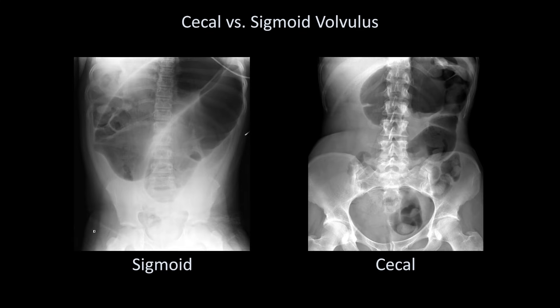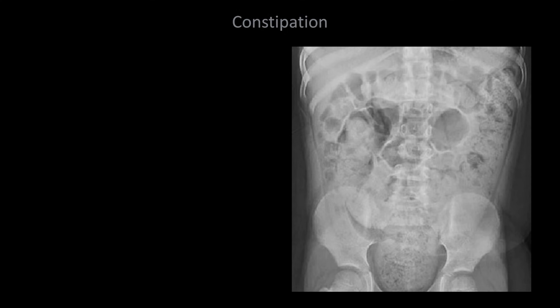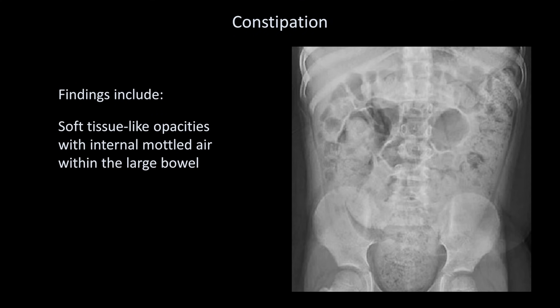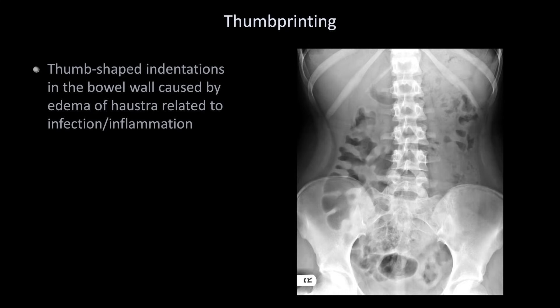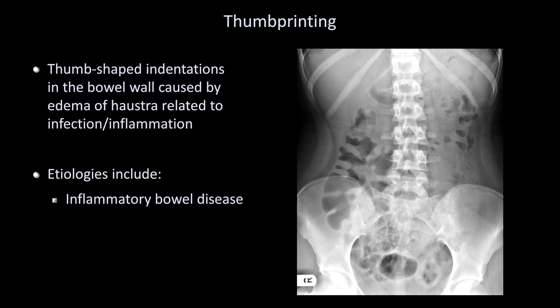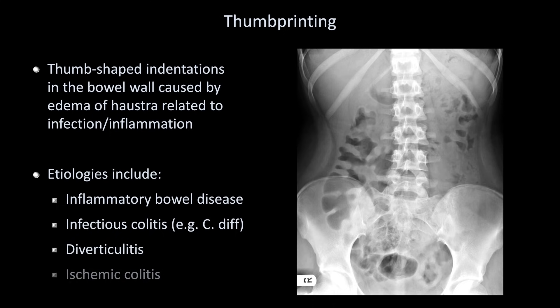Showing the two forms side-by-side for comparison — sigmoid volvulus is the more common form. Here is another classic and much more benign finding: constipation. We see soft tissue-like opacities with internal mottled air within the large bowel — that is all feces. Here is a finding called thumbprinting, in which thumb-shaped indentations in the bowel wall are caused by edema of haustra related to infection and/or inflammation. It is most classically associated with inflammatory bowel disease, but can also be seen in infectious colitis such as C. diff, diverticulitis, and ischemic colitis.